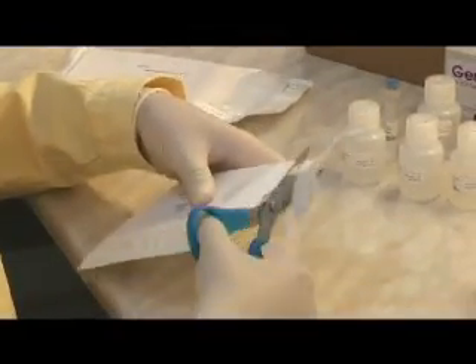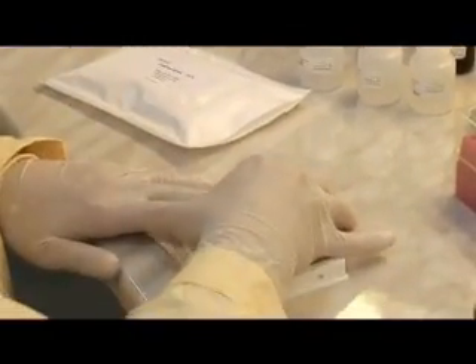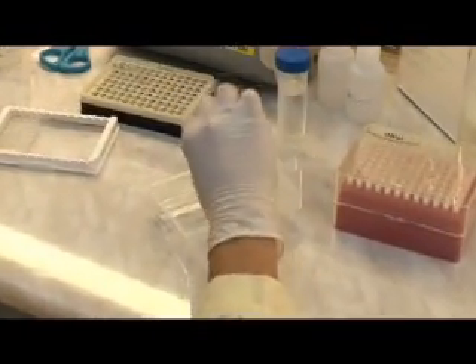The hybridization is carried out on a streptavidin-coated plate. If you would like to carry out fewer reactions than recommended, you may remove unnecessary strips and scale down the reagents prepared proportionally. Dispense binding buffer into each well using an 8-channel pipettor.